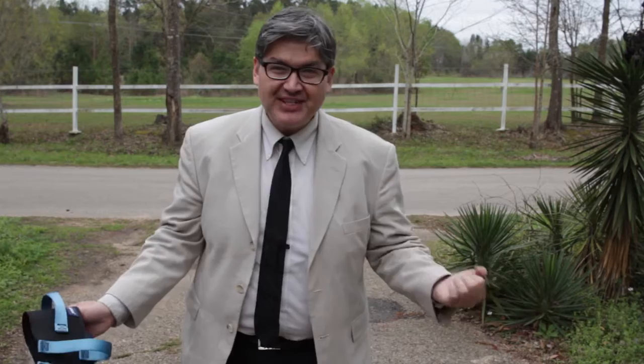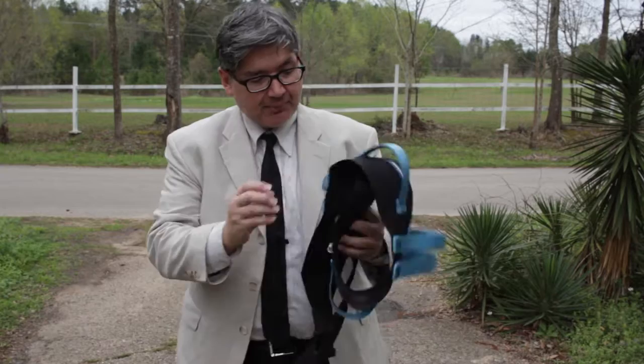Even someone that weighs like 150 pounds of dead weight on the ground — I'm pretty strong — but lifting up 150 pounds of dead weight is tough. You put this belt around them, you can lift with your knees, and it's not going to be a problem.